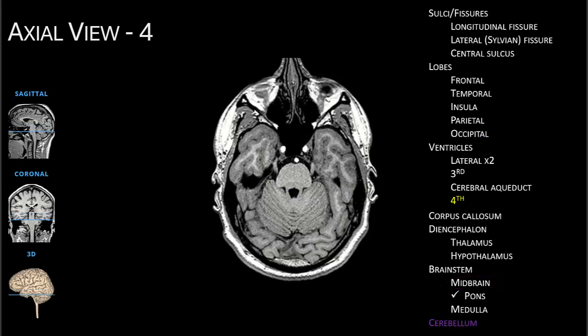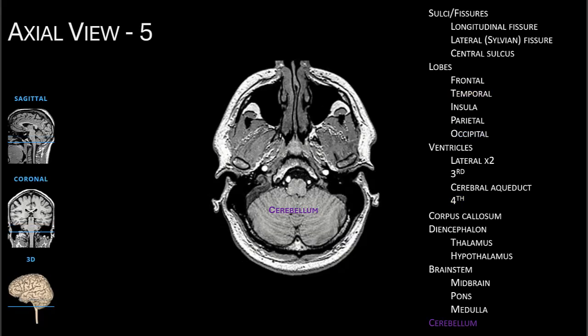Now we see the distinctive lines of the cerebellum appear, as well as the rounded belly of the pons. Between the two structures is the fourth ventricle, and we have the temporal lobe as well as the occipital lobe. Finally, we're at the level of the medulla, which looks a bit like a four-leaf clover.